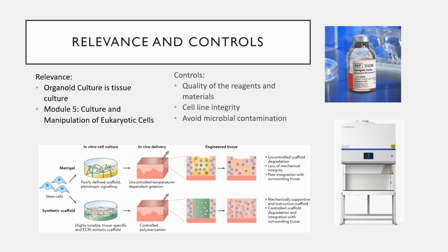The figure at the bottom is from a paper looking at synthetic alternatives to Matrigel. Matrigel is a commercially available extracellular matrix. This figure gives you an idea of how the extracellular matrix supports cells and organoids in general.